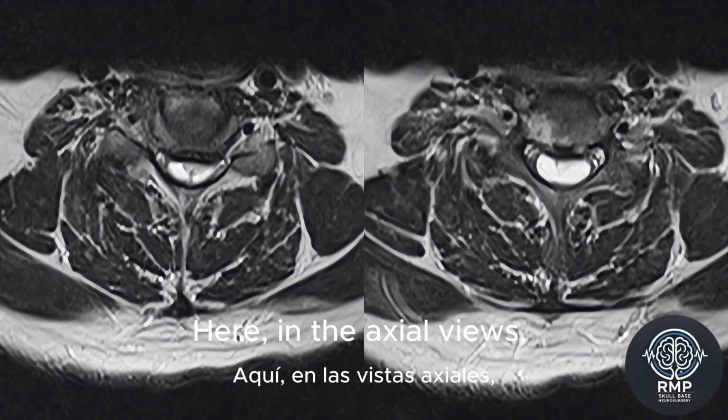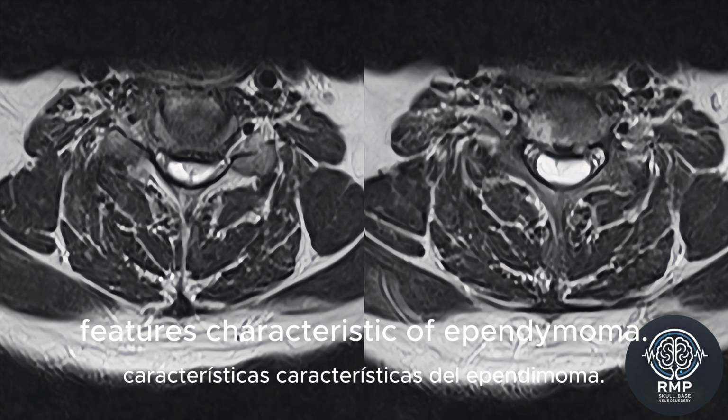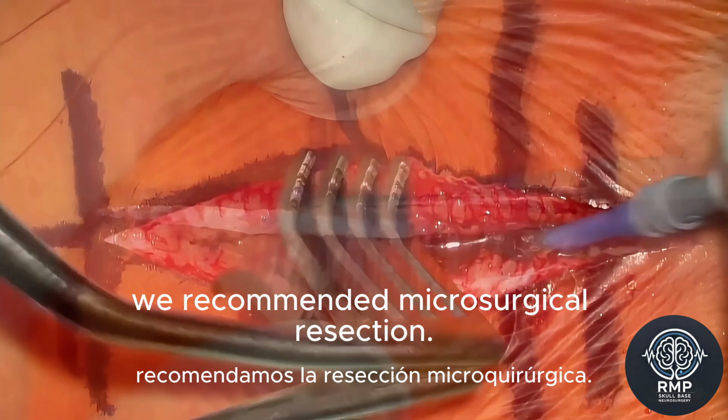Here in the axial views, we can see that the MRI revealed a central solid nodule surrounded by a cystic hemorrhagic cavity, features characteristic of ependymoma. Due to the patient's progressive symptoms, we recommended microsurgical resection.